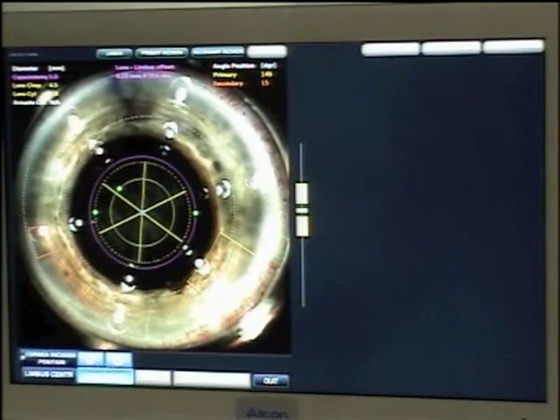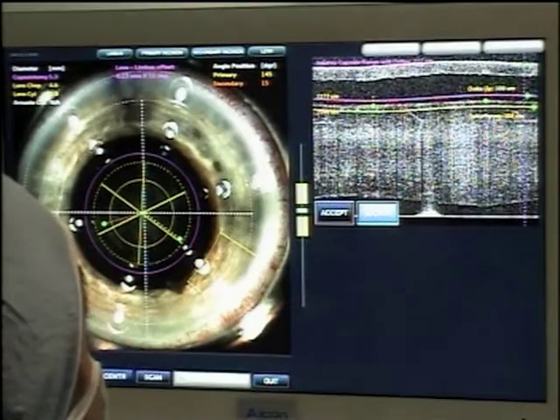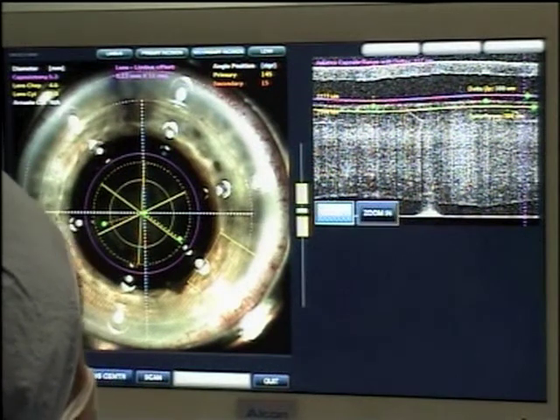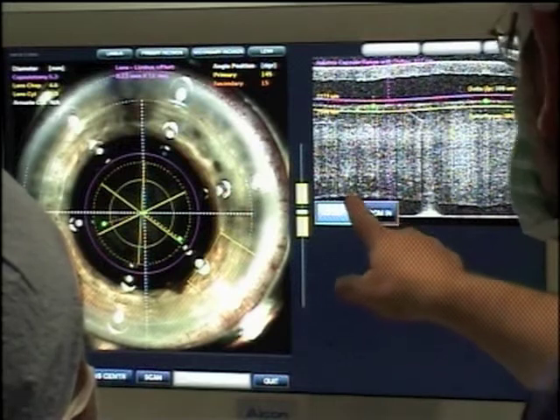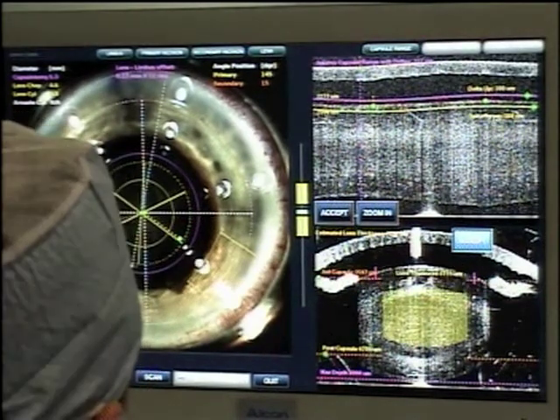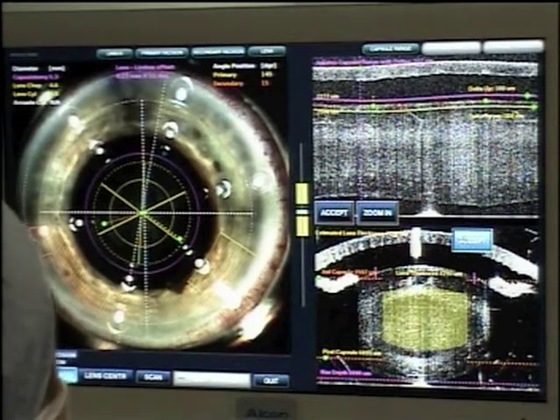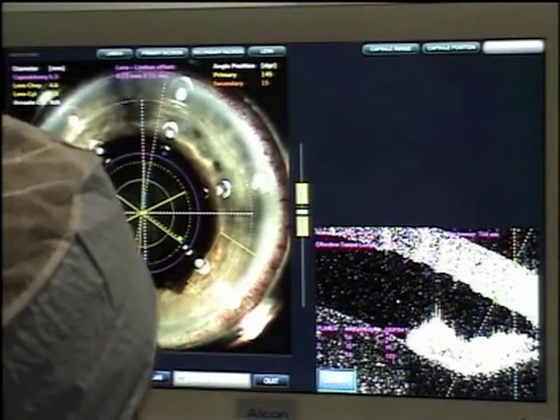Now we're adjusting the capsular rhexis. We have a very nicely dilated pupil, so I'll enlarge the capsular rhexis from 5 to 5.5 millimeters, and also my lens fragmentation. We're on live OCT now, and we're seeing all the measures: cornea thickness, lens thickness. We're adjusting for the higher and lower lens thickness. As you can see here in the bottom right, we will enlarge the dissection of the lens with a femtosecond laser. It's the yellow area that you see. Obviously, it has to match the opening of the capsular rhexis.